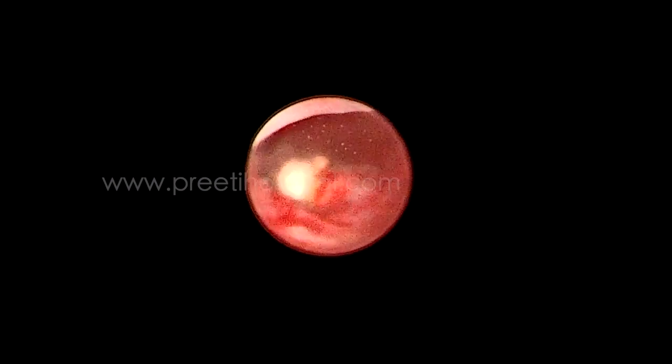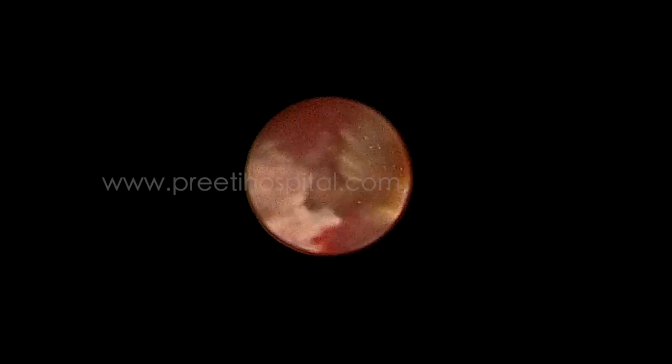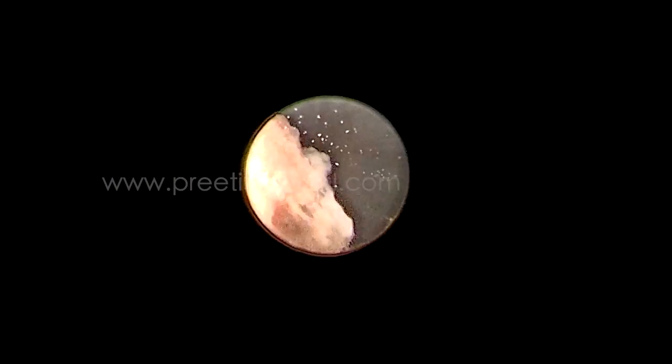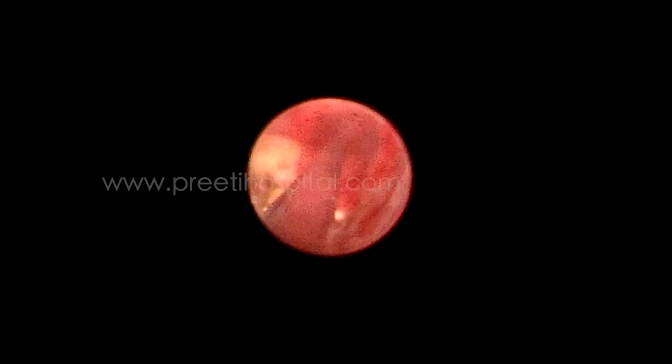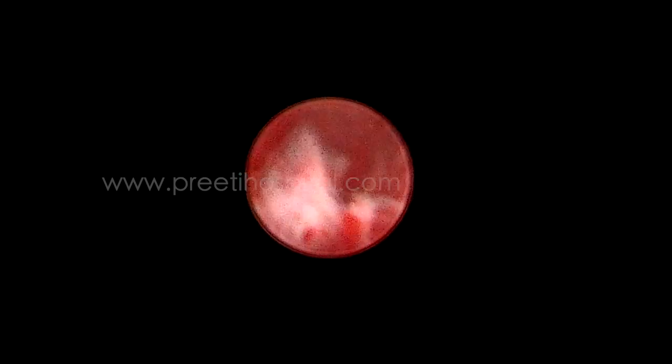That is, see, this is the upper pole infundibulum and the ability to go into the upper pole completely like this. And the moment you go there, the stone is coming out. Very less often triprong or biprong is used. Like this, only small fragments which were not floating. This is the last part where we are emptying the upper pole. So the entire pelvis and upper pole is collapsed and is in front of you. This is what we wanted to depict.